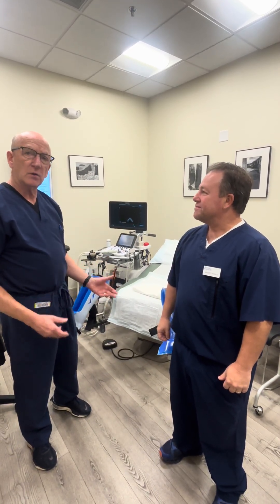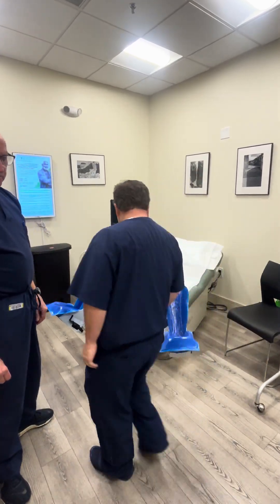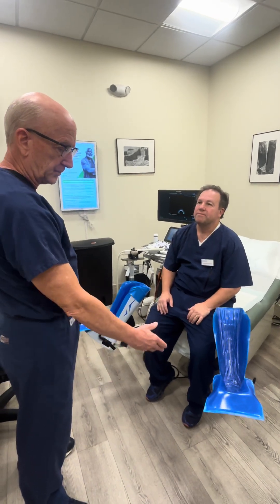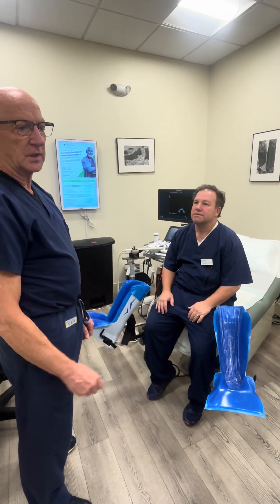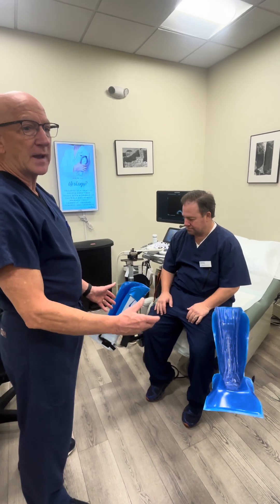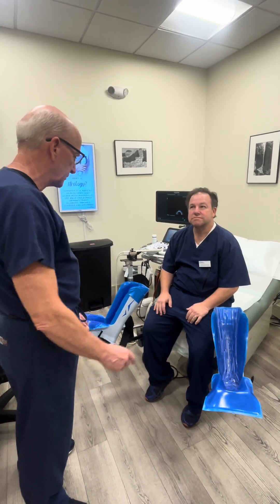I'm just going to show you how we position people on the GYN stirrups. Andres is going to have a seat. The stirrups are nicer than the regular metal stirrups. They support the calf and the heels much better. Also, when you first put your needle in, the patient has a tendency to jump, and sometimes the feet would slip off the other stirrups. So I'll just put your legs up there for me.